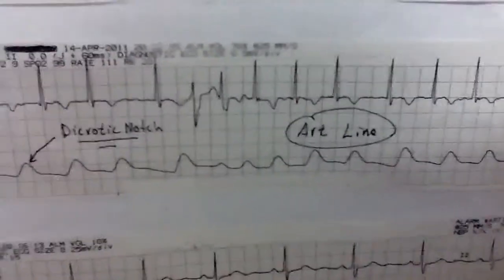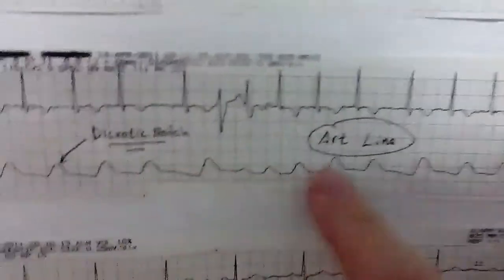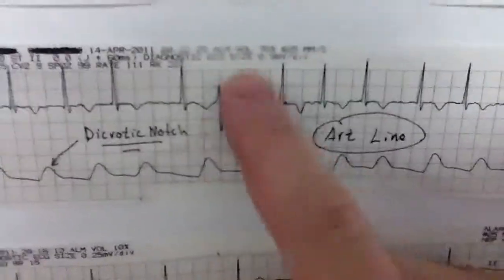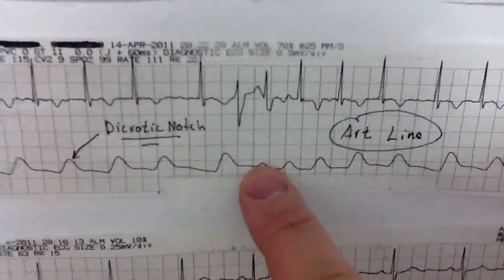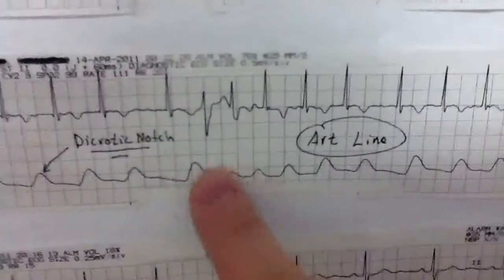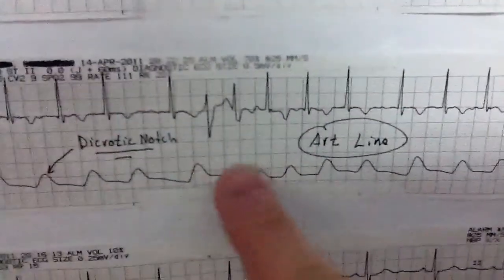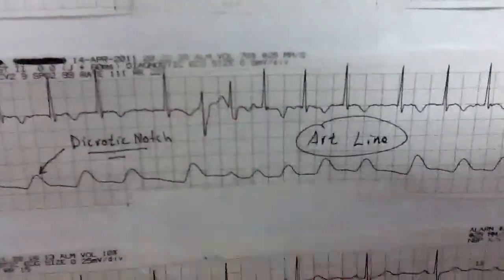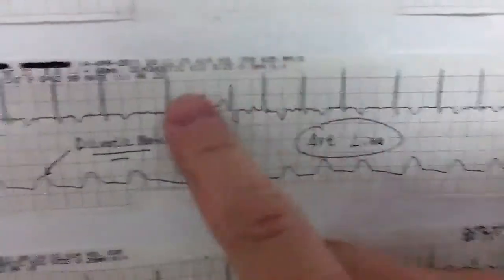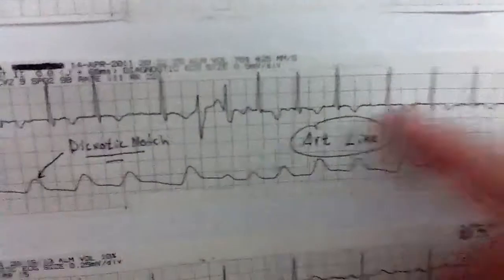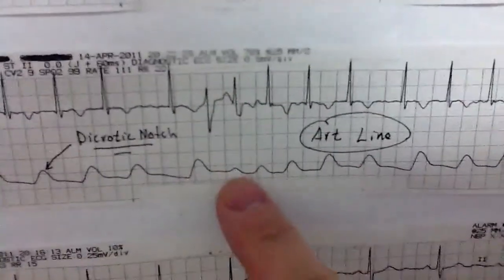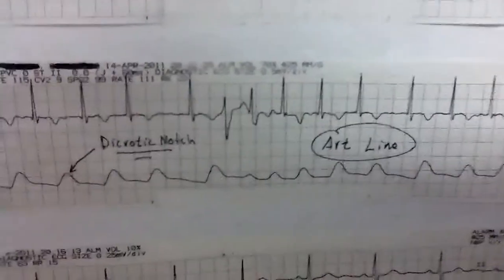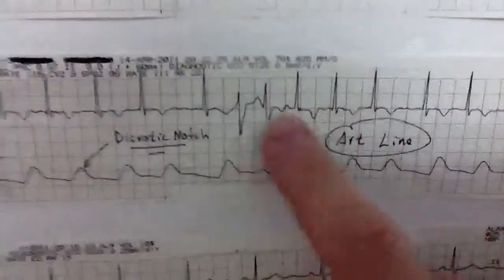Again, these are not taken in a sterile environment — these are real patients. You can see this patient has a PVC here, and you can automatically tell that the PVC is not perfusing. It doesn't create the pressure that a normal beat would. This is one of the concerns you get when you have lots of PVCs or several in a row — that's actually called ventricular tachycardia — where you don't have a really good cardiac output.